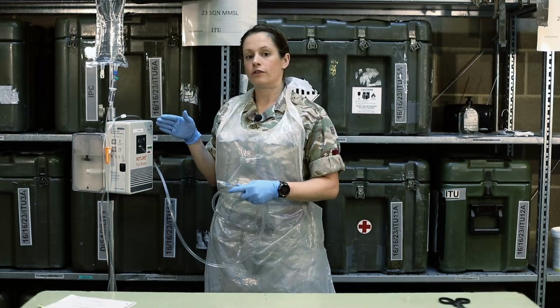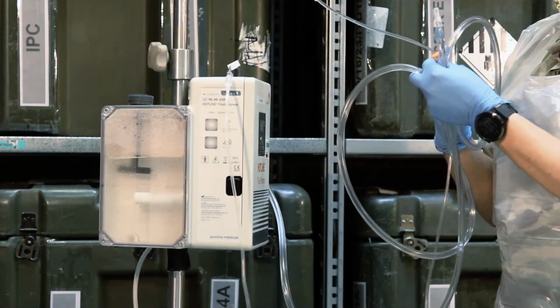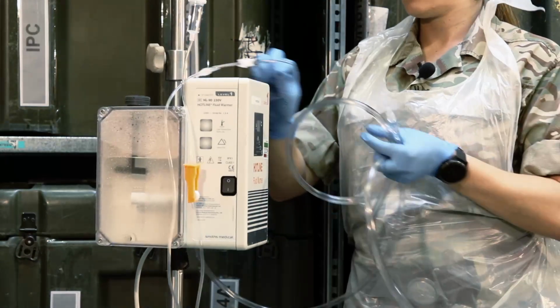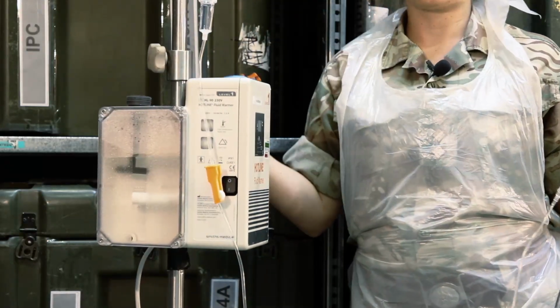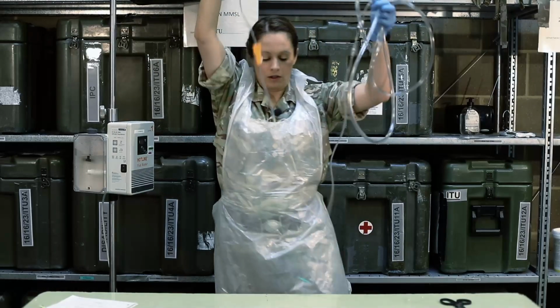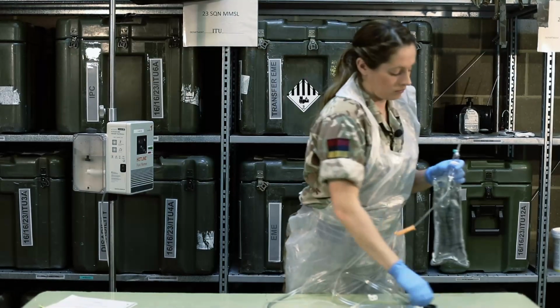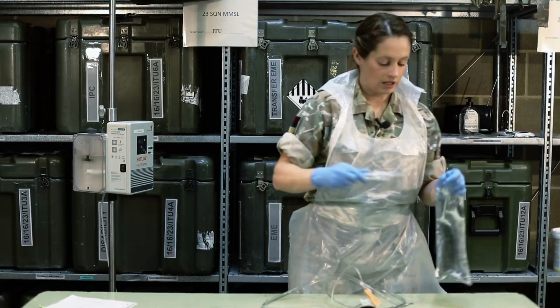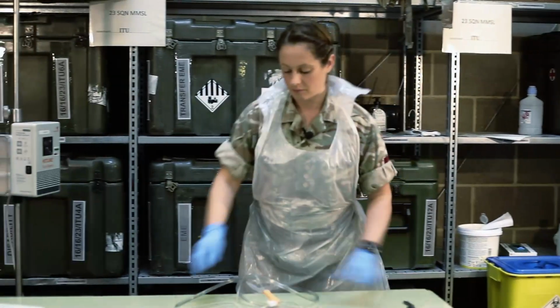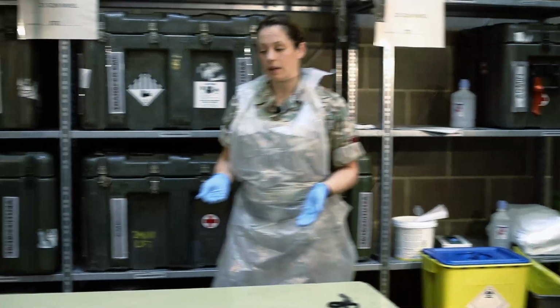So when it comes to disposing of the consumables, when the patient treatment is finished, I'm going to clamp all the lines, turn off, detach it from my patient, turn off the Hotline warmer, unplug the set, which will get some water coming out of it, and that's absolutely normal, and re-plug in the port hub, bring my fluids down, dispose of that as a sharp, and remove all this into clinical waste. As you can see, it can be quite messy.